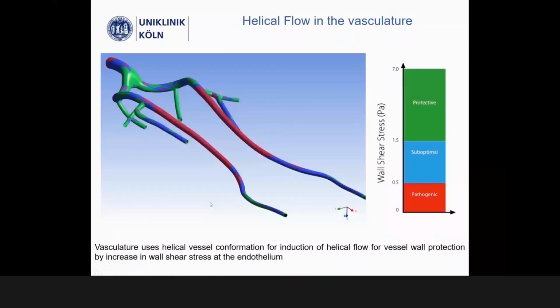Also in other regions of the vascular bed, you have helical flow that occurs naturally, and this helical flow induces wall shear stress, which, as I mentioned before, acts as a physiologic stimulus on the vessel wall and has a protective nature.